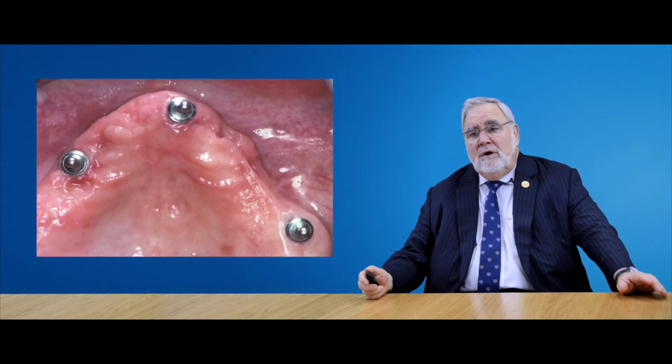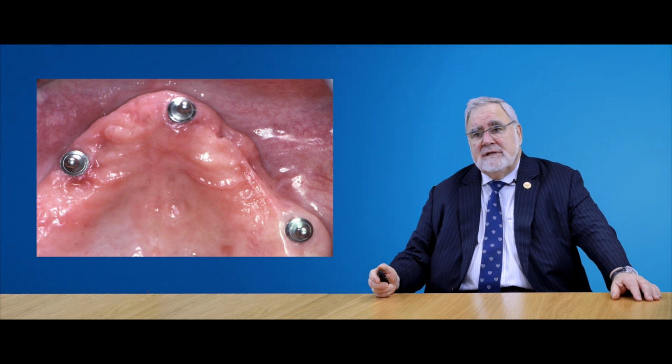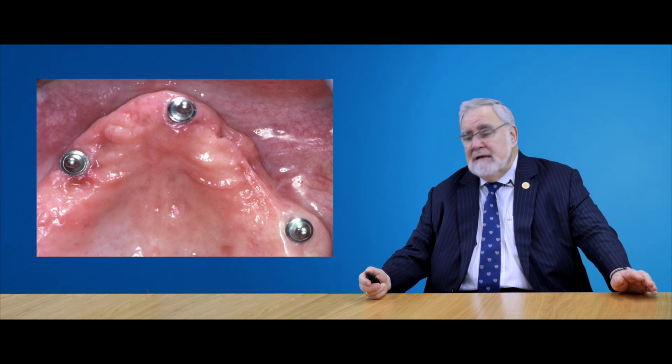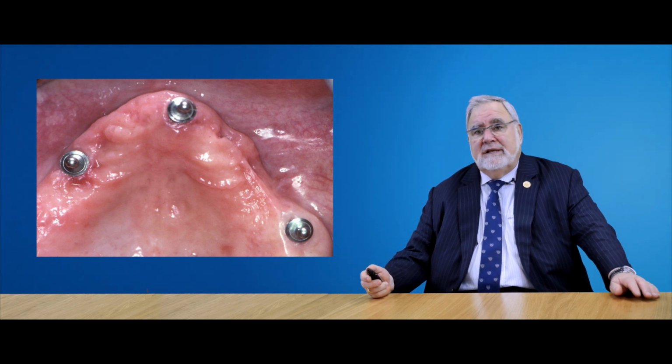Now, we can also improve chewing function in edentulous patients that have no teeth, obviously, and when it is difficult to anchor a prosthesis that is maintained or stable on suction, we can add single implants here that will improve the retention of the denture.